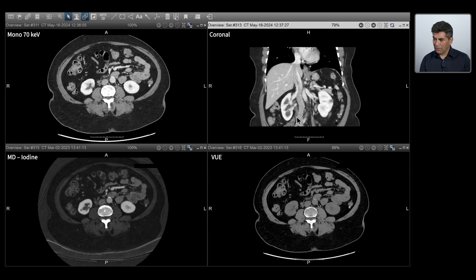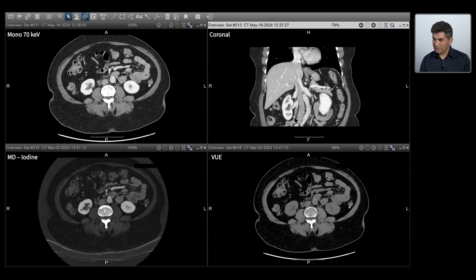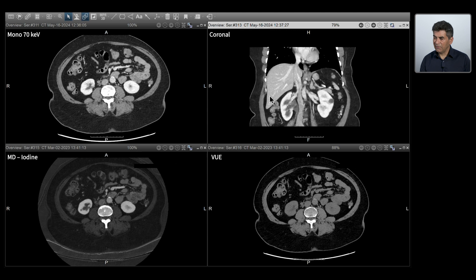We go down, looking at everything else. I'm satisfied — I don't see any lymphadenopathy.